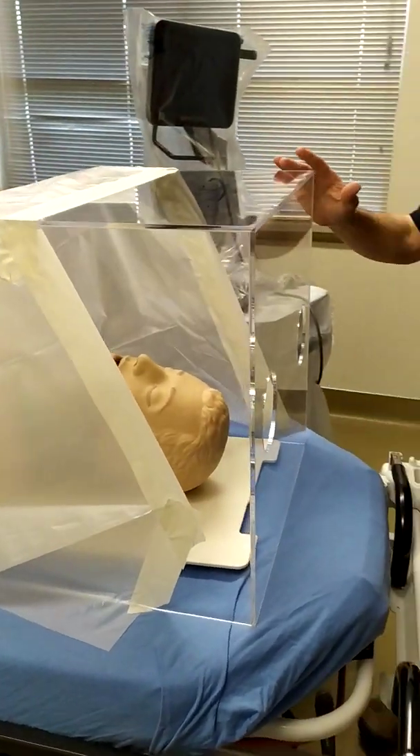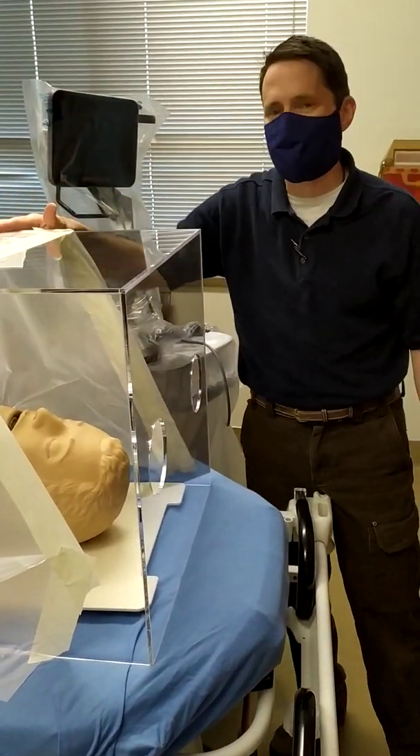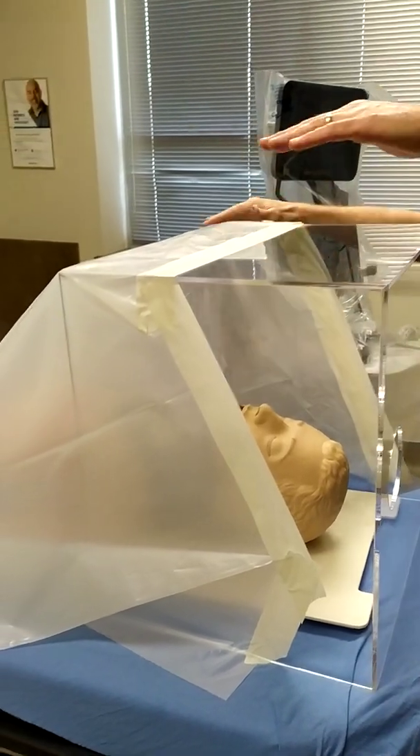In addition to this, we made a modification and put some plastic sheeting down at the base so it'll provide even more protection.